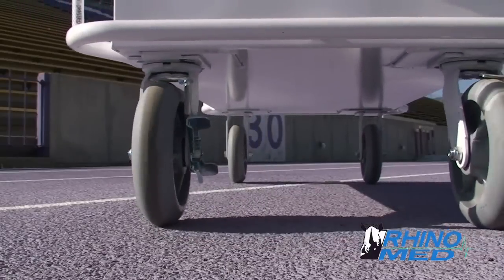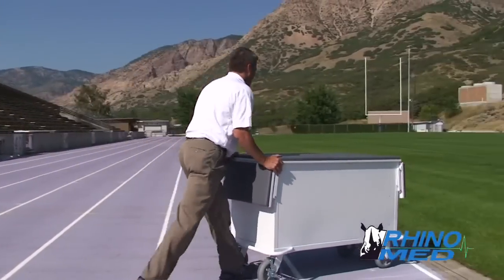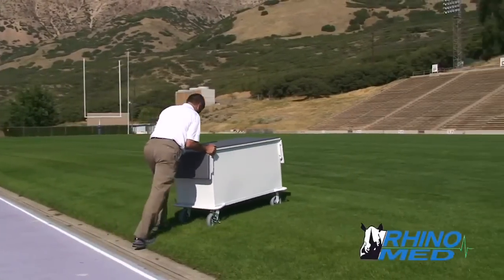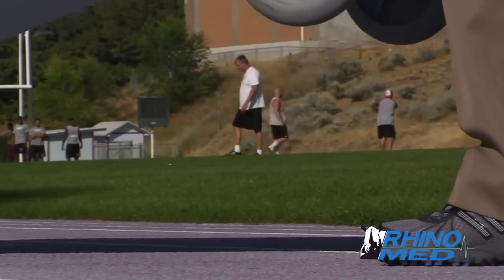Heavy duty solid rubber wheels swivel on one side and lock in place to create a RhinoTuff mobile solution that can be used anywhere, even on grass. Grab handles make lifting the cart easier.